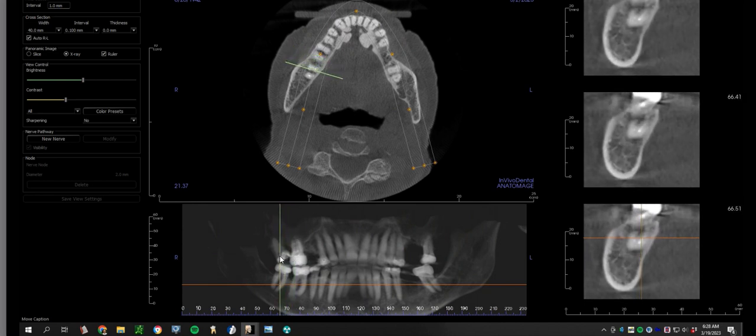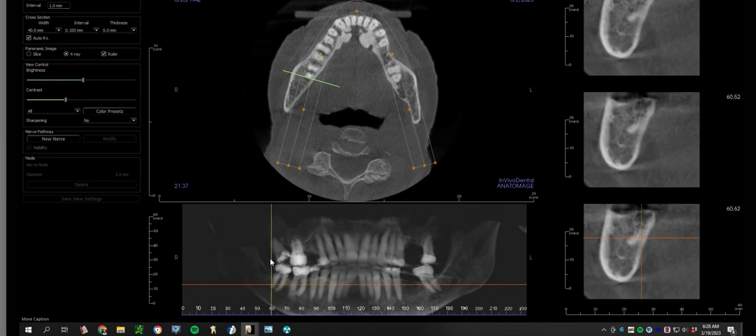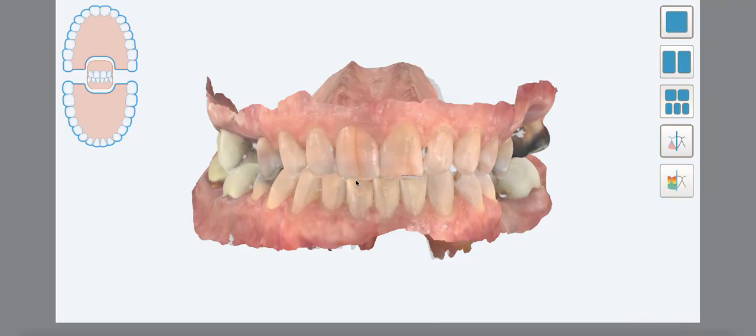And then number 31 looks relatively okay, even though the fill seems rather short. The bone around it seems okay. Important to note, look at the proximity of the root tip in relation to the nerve. So if this tooth ever needed to come out and you wanted to degranulate that area, something you'd want to be careful for. So in a nutshell, that's the radiographic analysis of the CAT scan that I think is important for these comprehensive treatment plans.